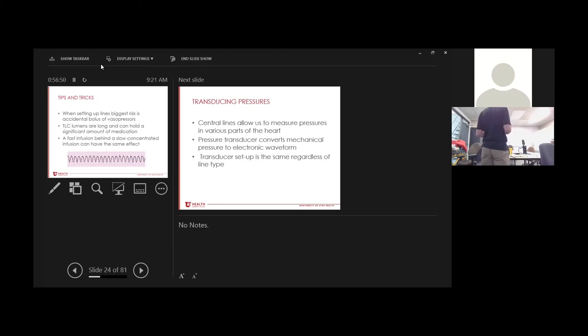Epinephrine usually, if you're on multiple pressors, vasopressin usually goes at 12 cc's an hour. So you want to bleed your norepinephrine at 2 cc's an hour, a slower drug, into the faster drug. Does that make sense? Slow into the fast. And then you just look at what the drug is. If heparin, if you bolus a couple cc's of heparin, it doesn't matter. In the end, they're going to get the same amount of heparin. So bleeding pressors into non-pressors, and slow into the fast, are pretty much your baseline rules.